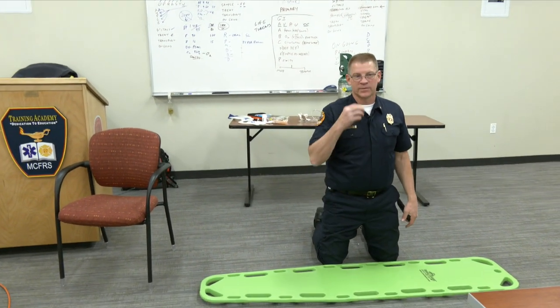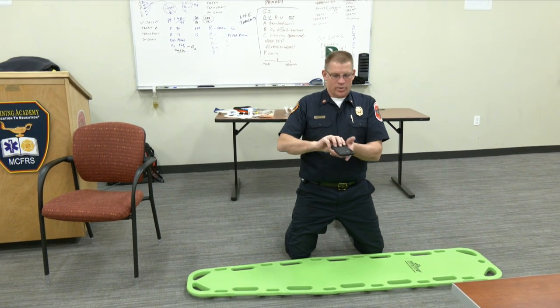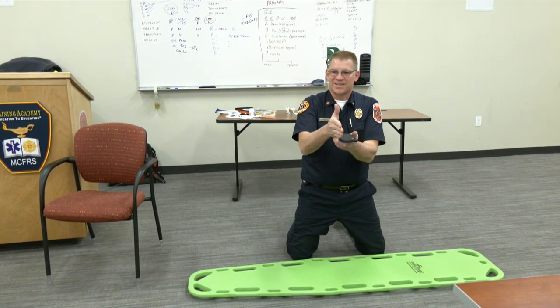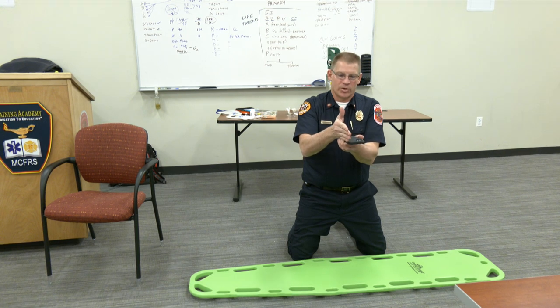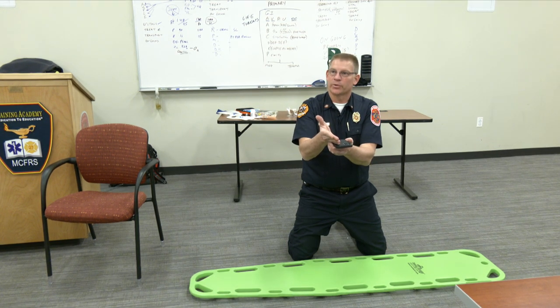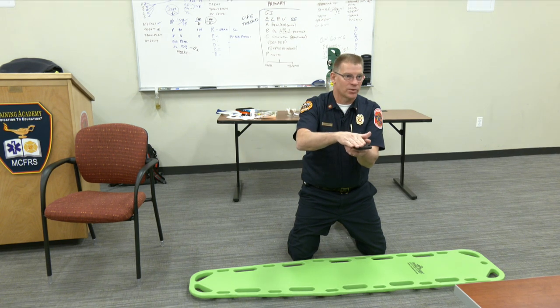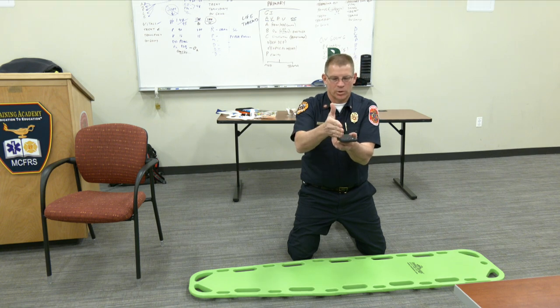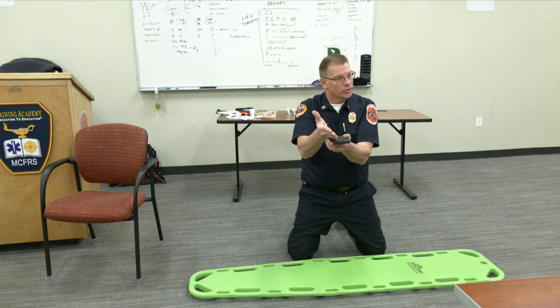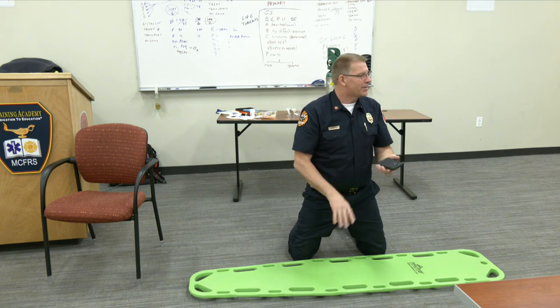Is that correct or incorrect? Incorrect. So let's think about this. We are taking a patient, we are rolling them up to 90 degrees, then we are rolling them a little extra — to allow the board to get farther under them. Because when they're at 90 degrees and we lay them down, they're usually short on the board. So if we roll them past 90, go a little further, it lets the board go under further, so when they lay down, they tend to be on the board more.